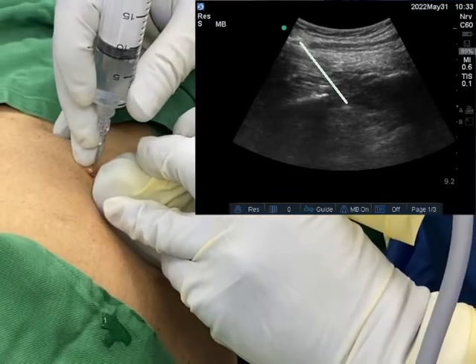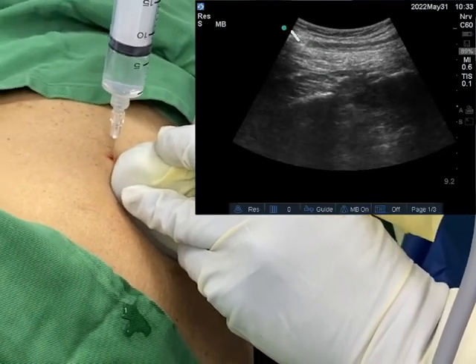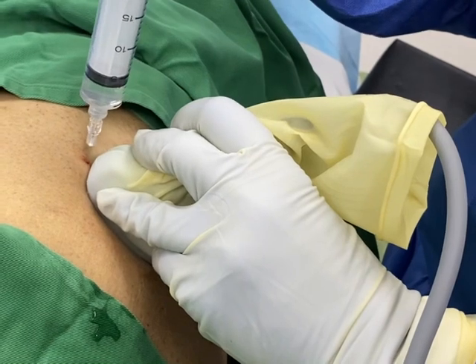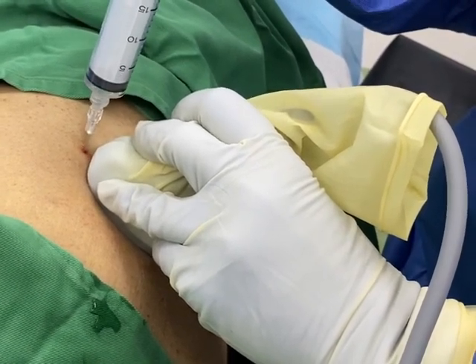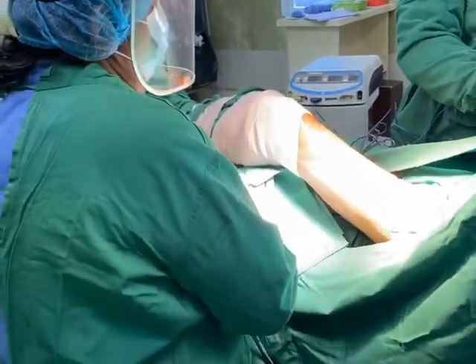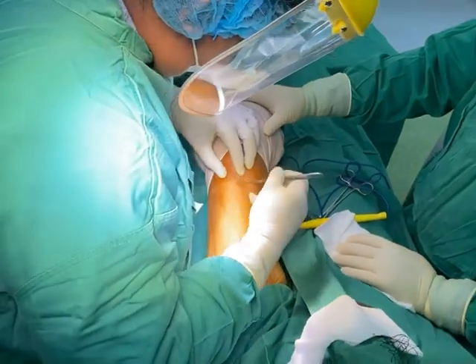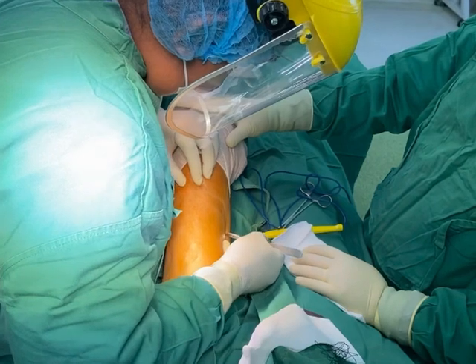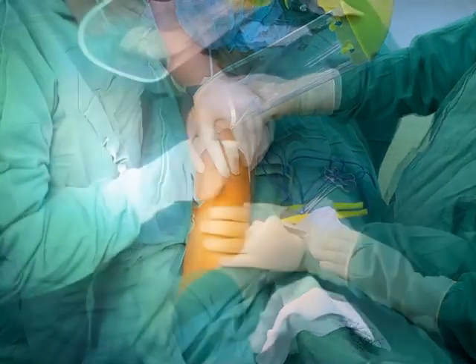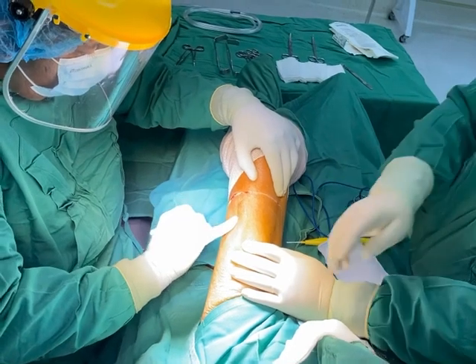Allow 15 to 20 minutes for this block to take effect and your patient is now ready for surgery. Above knee amputation can proceed in this high-risk patient even without giving general anesthesia or central block — spinal or epidural anesthesia. Thank you very much.